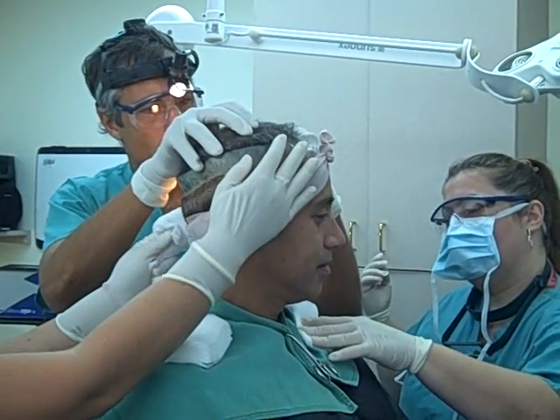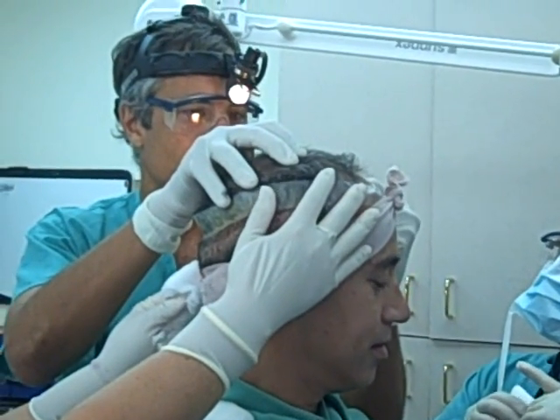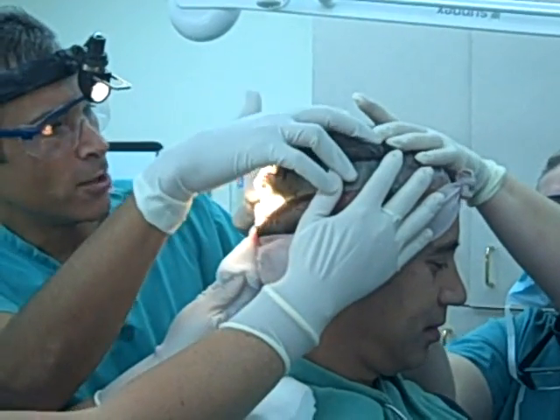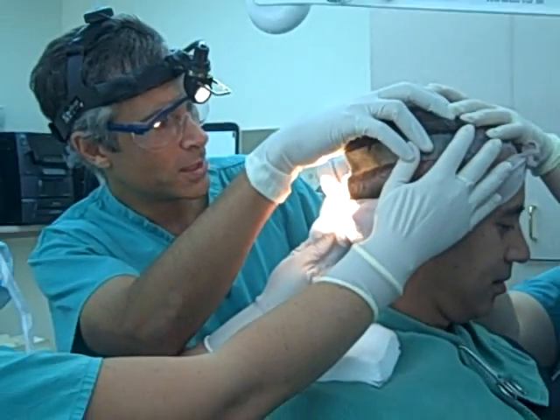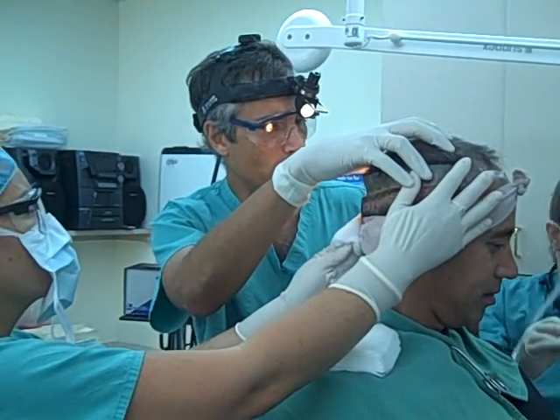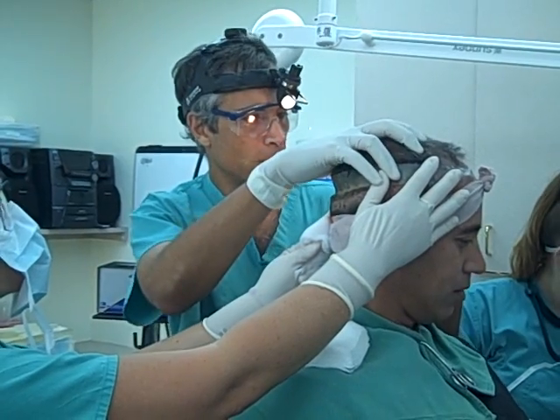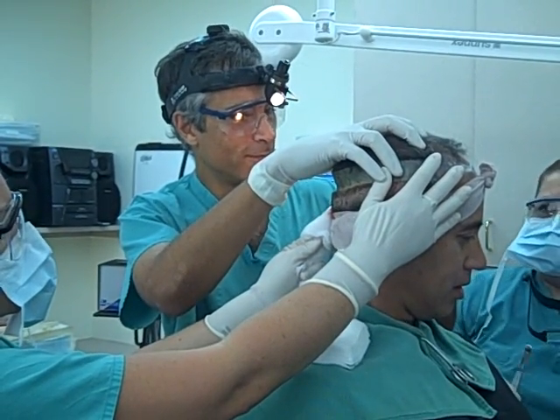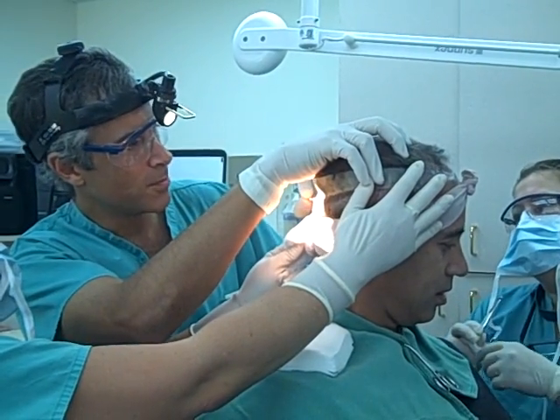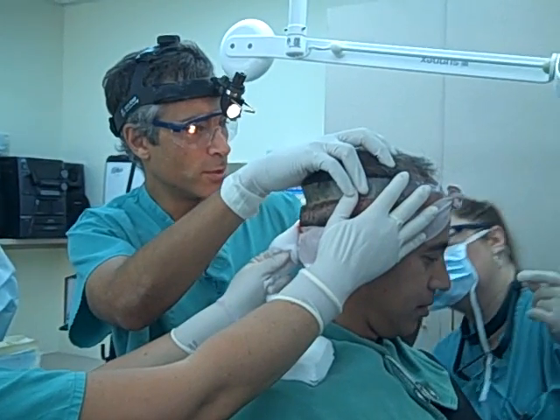You know, we were talking about whether it's better to have patients lying head down versus sitting up, and I always do my donor strips with the patient sitting up like this. I just think it's less claustrophobic, it's more comfortable for them. Let it run the right direction. Exactly, less pressure up there. You're not going to bleed as much because there's less pressure down there. And obviously you seem pretty comfortable doing this.